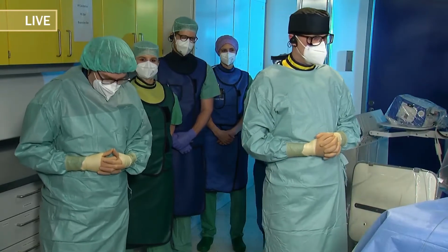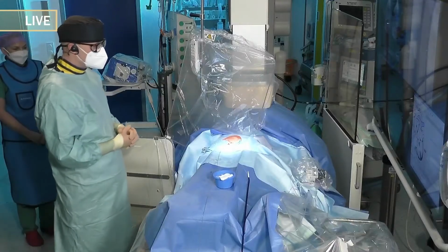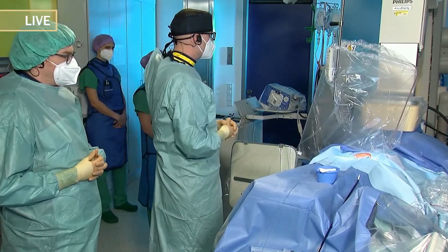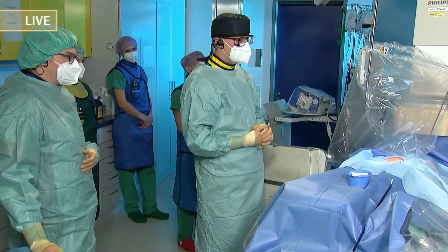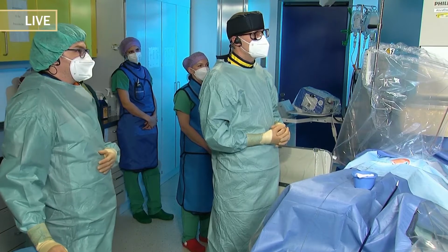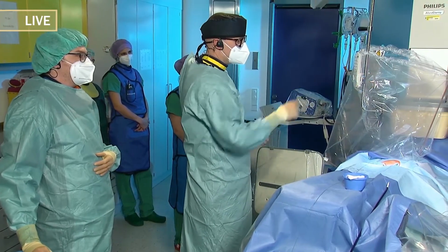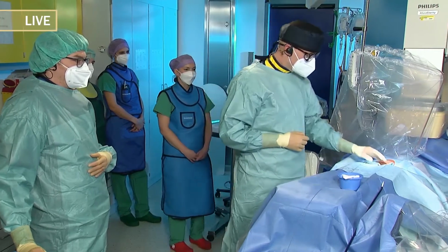So our patient is here in supine position in our hybrid OR. We have the fluoroscopy here. The patient is intubated and ventilated, which we usually do for these kinds of procedures as we place a transesophageal echocardiography probe, and the patient needs to be in a stable position over time. The echocardiography is placed on the other side, and we have already started the case.